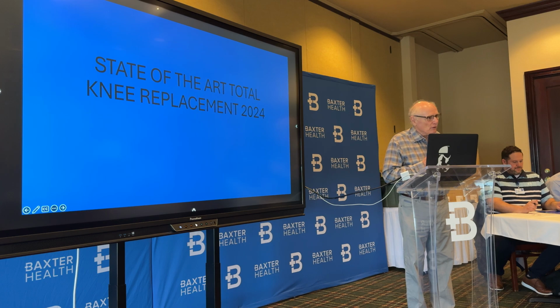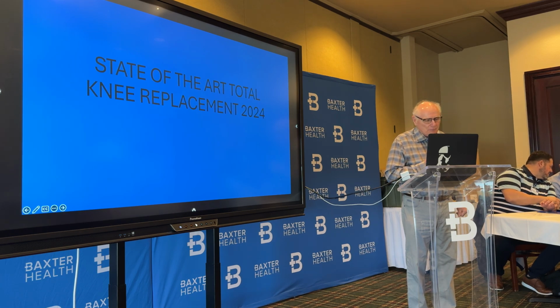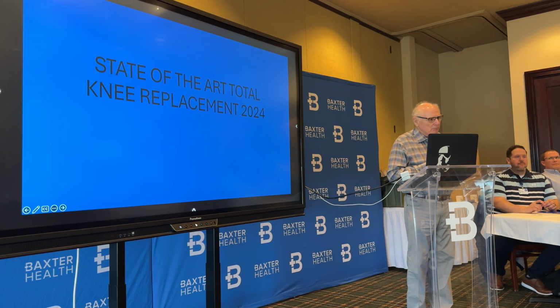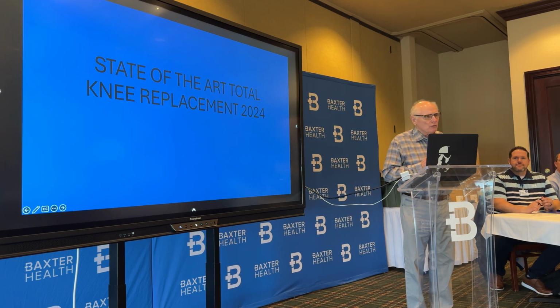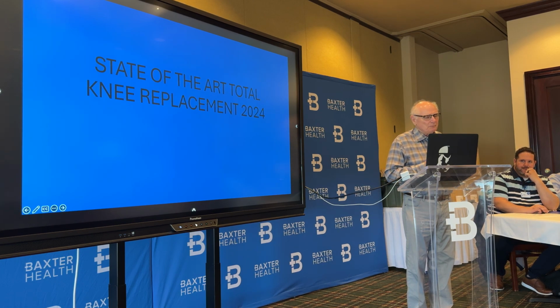All 6 orthopedic surgeons in this community are using the CORI system, the current system we have. And as an overview, what does this system do? Robotic surgery has been something that, before, on all other systems, requires getting a CT scan or an MRI, and then that goes to the respective factory of the manufacturer of that device. Their engineers look at that data and then send you back a plan.